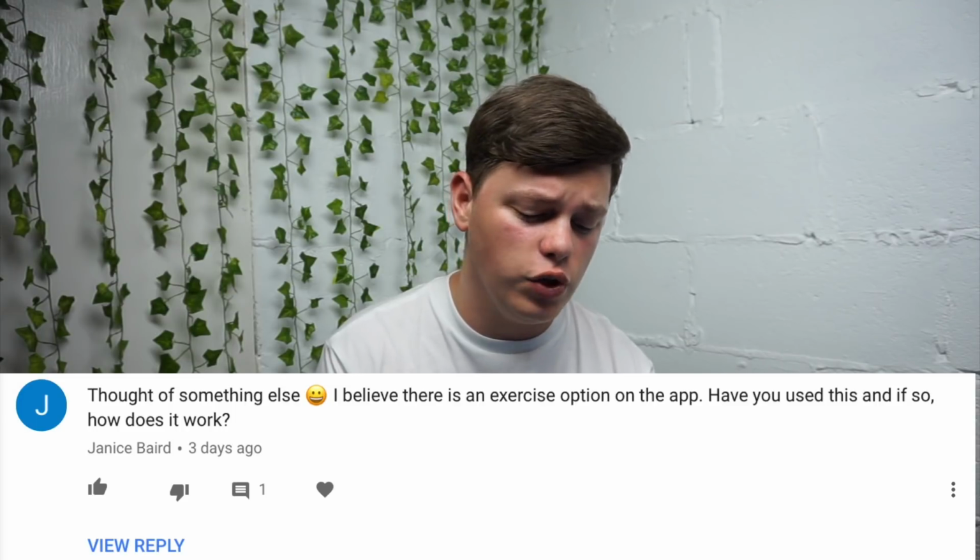Next, I believe there is an exercise option on the app. Have you used it? And if so, does it work? Yes, there is a thing called workout target, so you can set a different target. So Loop is instructed to keep me between 5 and 5.3 all the time, but before I go and have a swim workout or something, I do set my workout target. So before that, Loop is instructed to make sure I'm between 6 and 9, I think, before my workout. So that gives me, you know, a bit more security, and it does work, and I quite like that feature.